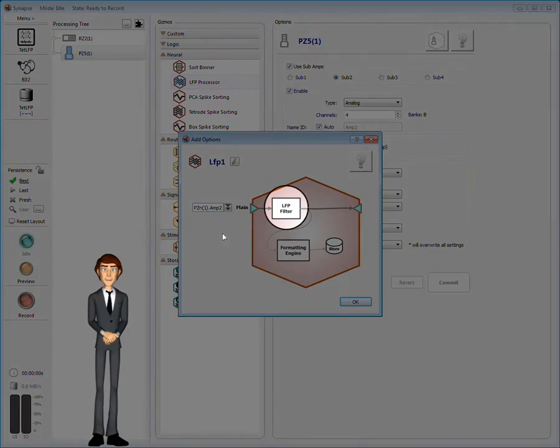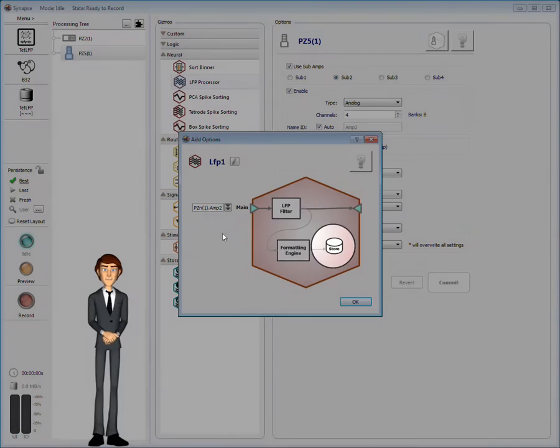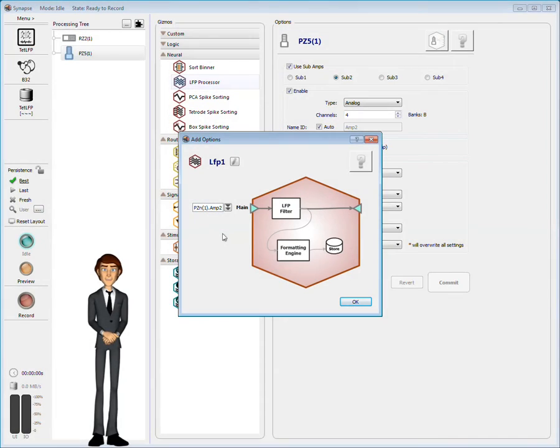This gizmo includes its own filter and data storage. We can also see the data type for each input and output.